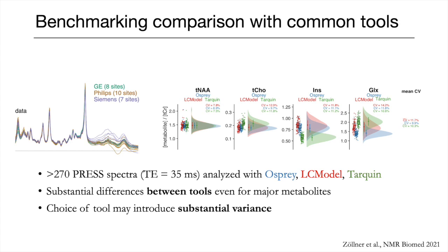Dependence of results on pipelines is something that we have seen in other neuroimaging fields too. For MRS in particular, expect more research into the sources of these discrepancies and ways to improve them.